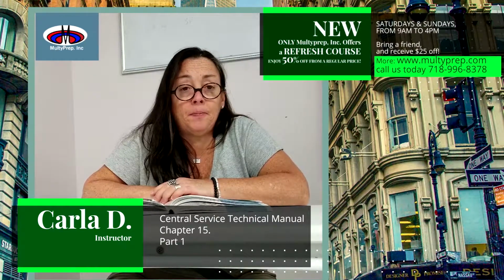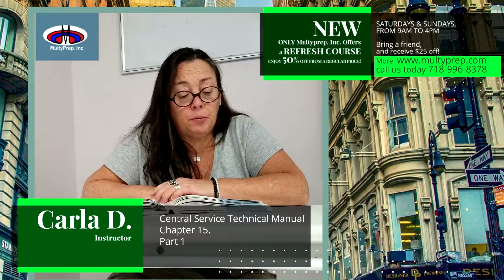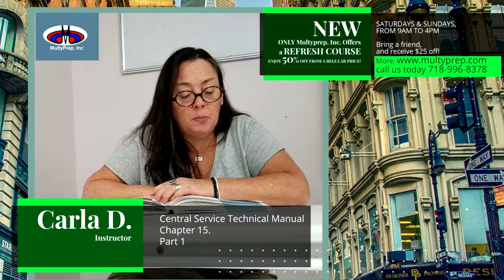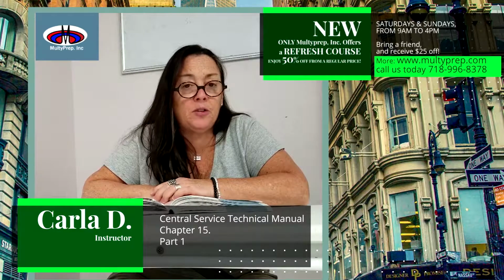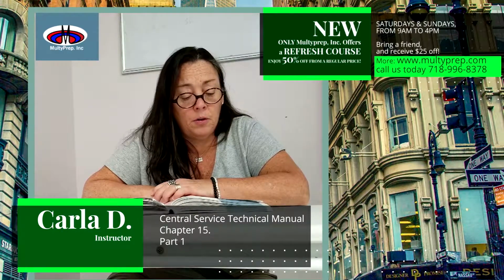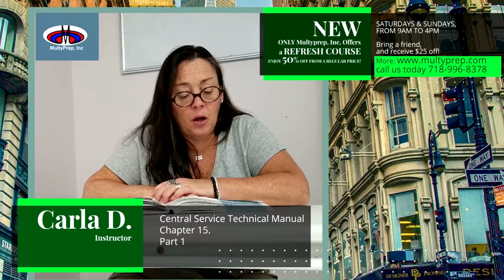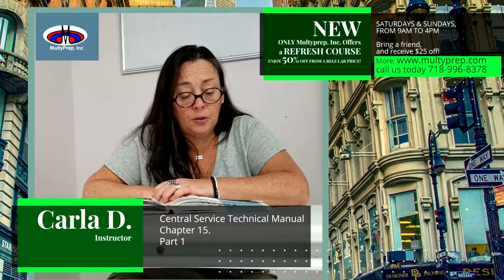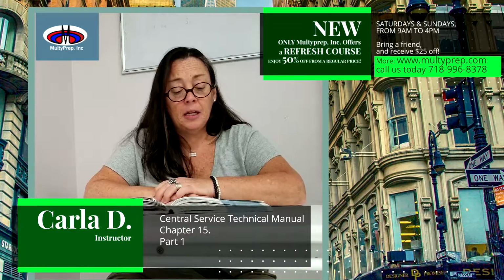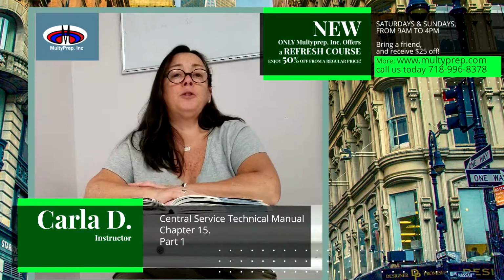Materials compatibility. Medical devices and surgical instruments are composed of a variety of materials that may be affected by ingredients in sterilants. Therefore, sterilizers must be tested to establish compatibility with a wide range of materials. Medical device manufacturers typically test the compatibility of their instruments with one or more of the available sterilization technologies. Therefore, manufacturer recommendations should be followed to help ensure successful sterilization, instrument integrity, and prevention of damage that may increase costs and limit the availability of instruments for patient procedures.